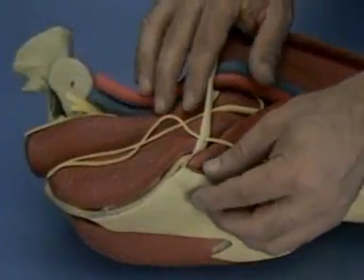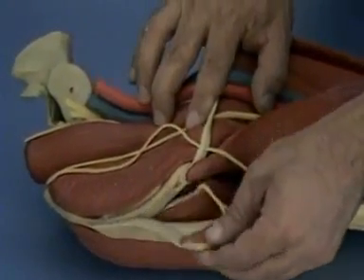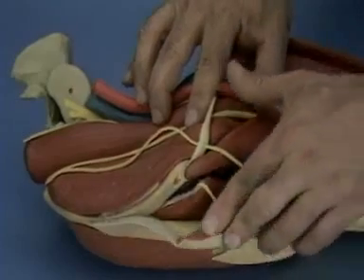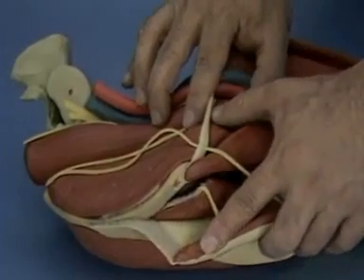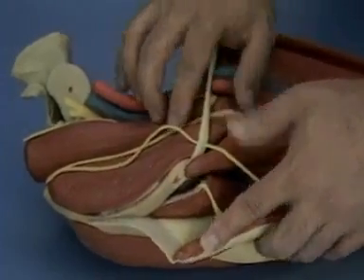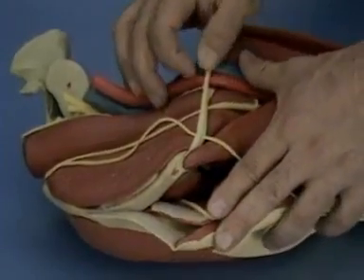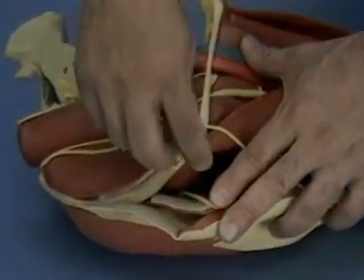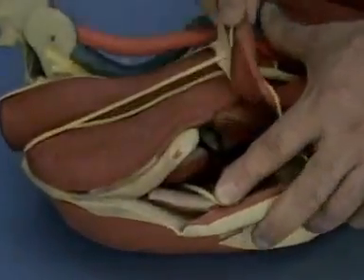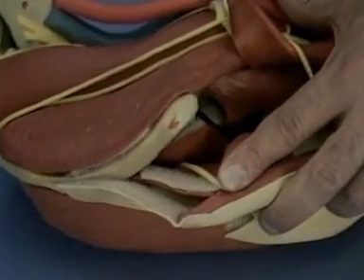There is also a possibility for limited access to the external aspect of the iliac wing by detachment of the tensor fascia lata origin and by detachment of the sartorius and inguinal ligament attachments to the anterior superior iliac spine.